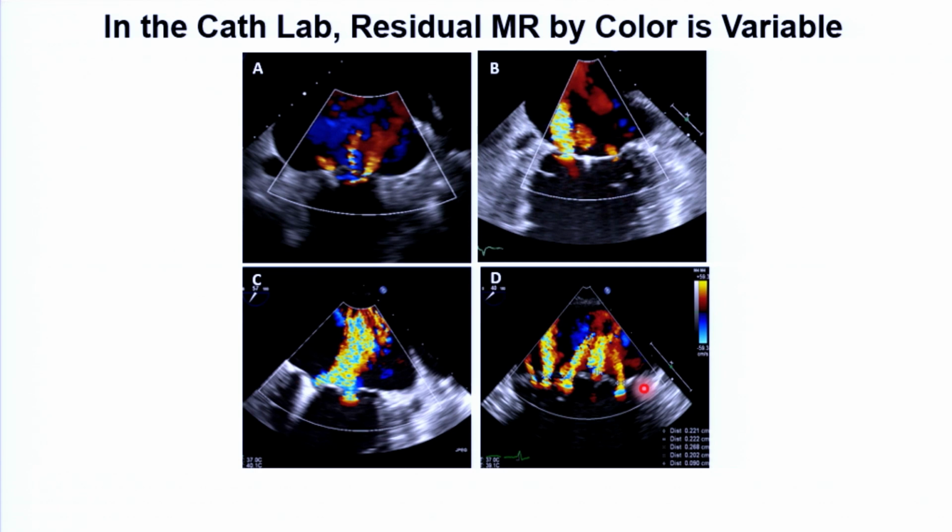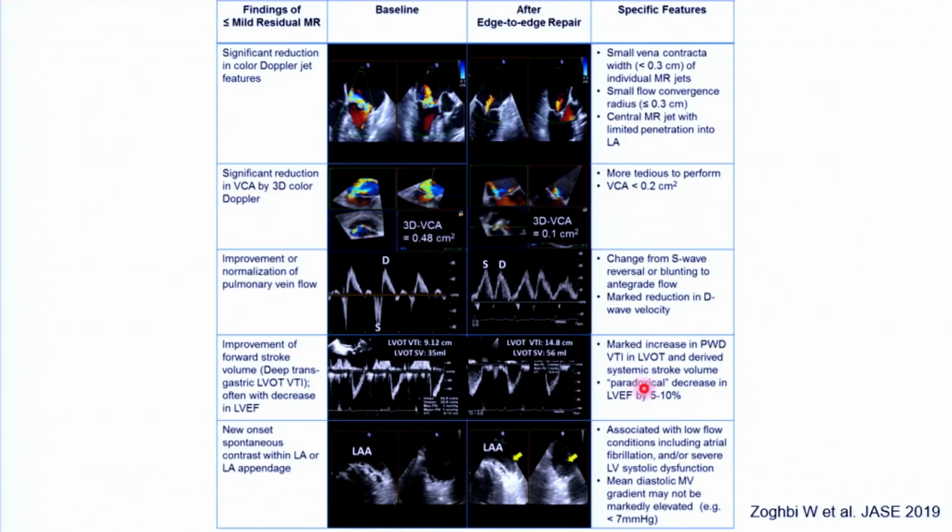And they could be crisscrossing. You could have multiple of them. And therefore, yes, it's important to know what you have residually, but you have to combine it with some hemodynamics. And the hemodynamics usually in this situation is very important as the pulmonary veins. And I think prognostically it has shown that it has importance.